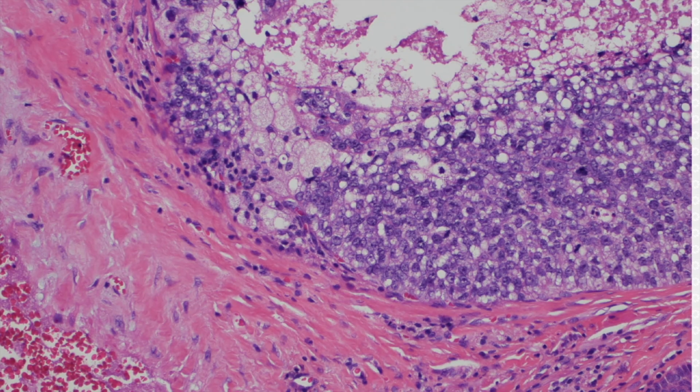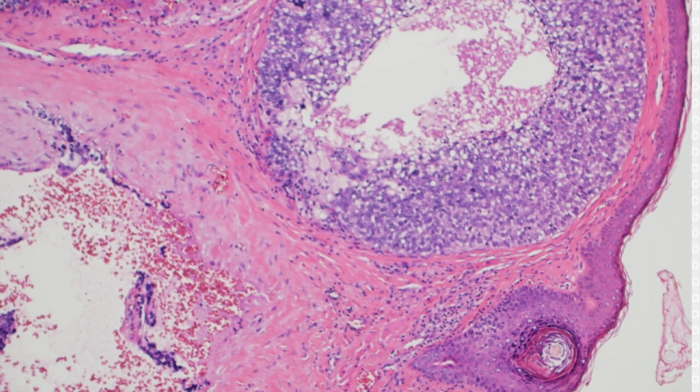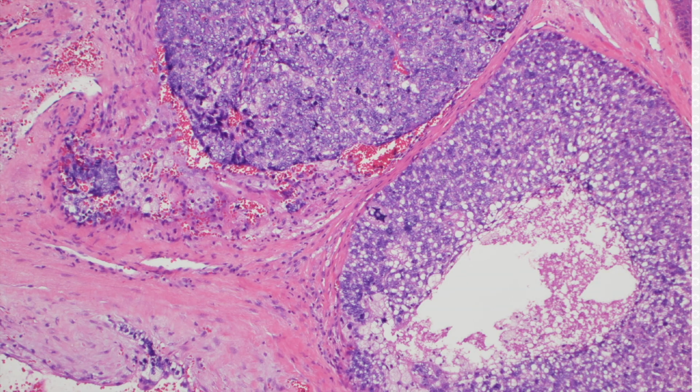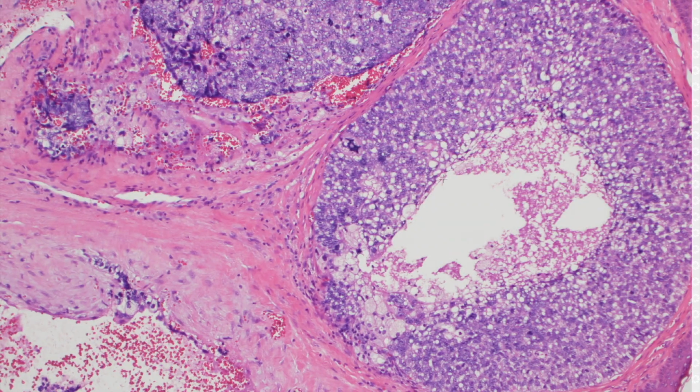So it can sometimes be hard to tell: do I have a squamous cell carcinoma or some other carcinoma with just some clear cell change or vacuolation, or is it actually full-blown true sebaceous differentiation? In sebaceous lesions, usually you can either tell it's malignant but you're not sure if it's sebaceous versus squamous or basal or something else, or you can tell it's sebaceous but have trouble deciding if it's malignant or not. So it depends on whether it's a poorly differentiated sebaceous carcinoma like this one, or the well-differentiated ones, which can be hard to tell apart from sebaceous adenoma and sebaceoma. Look at that atypical mitosis right there.